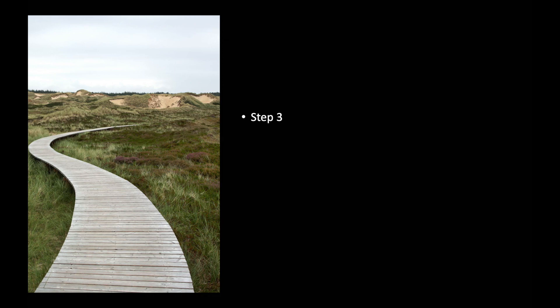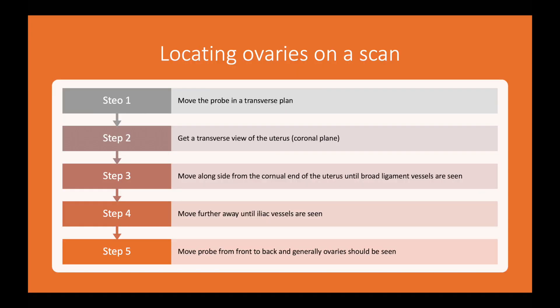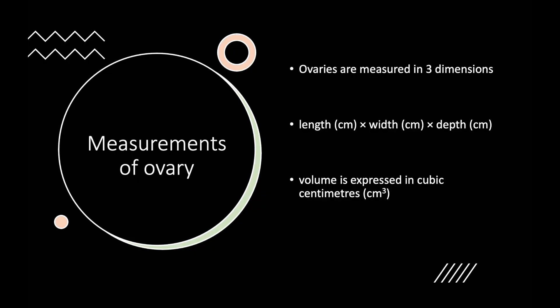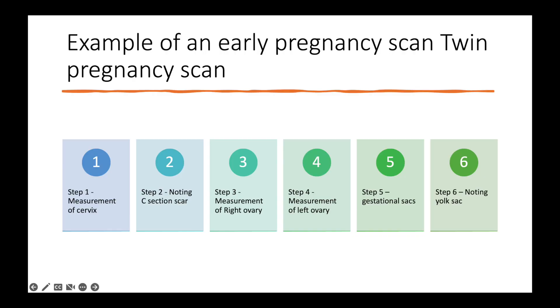Step three is to look for the ovaries. After the probe is twisted into the transverse position, it is swept from left to right and the ovaries are seen on either side of the uterus. Ovaries are measured in three dimensions — length, width, and depth — and their volume is expressed in cubic centimetres.